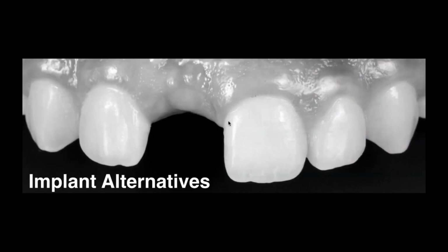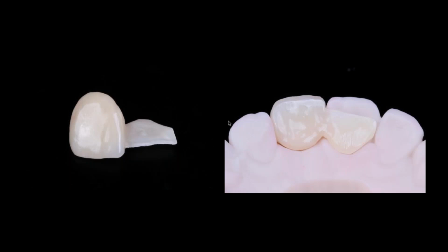Okay, implant alternatives. We can also use zirconia for resin-bonded fixed dental prostheses. Sometimes we have patients that are 18, 19, still very young for placing an implant, or patients with certain systemic complications. We can go ahead and design this with 4% yttria-stabilized zirconia. This is a monolithic zirconia restoration bonded to the tooth with the APC concept: air particle abrasion, primer, and cement. And if we're bonding to enamel, we will always etch the enamel, apply a bonding agent, and then do the final cementation.